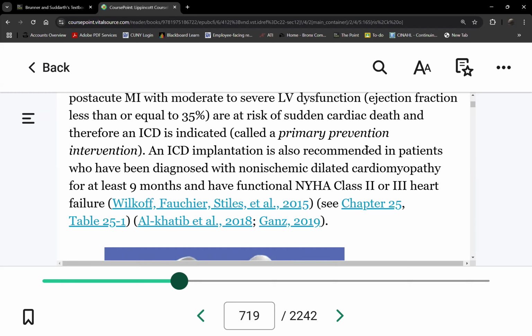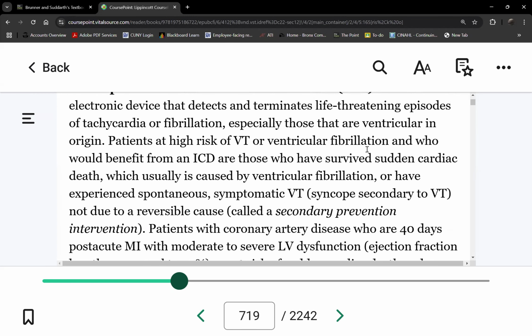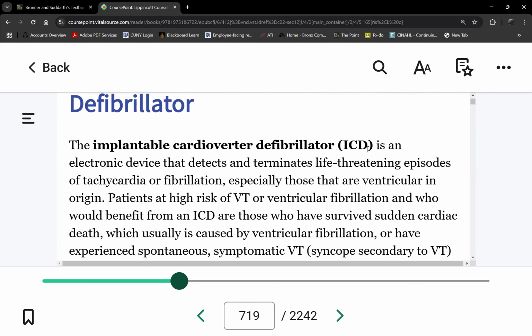No, like I said, the vest is only if you have an infection of some sort. Okay, we cannot implant the ICD yet. But of course, our goal is to implant the ICD in your chest. Does that make sense?